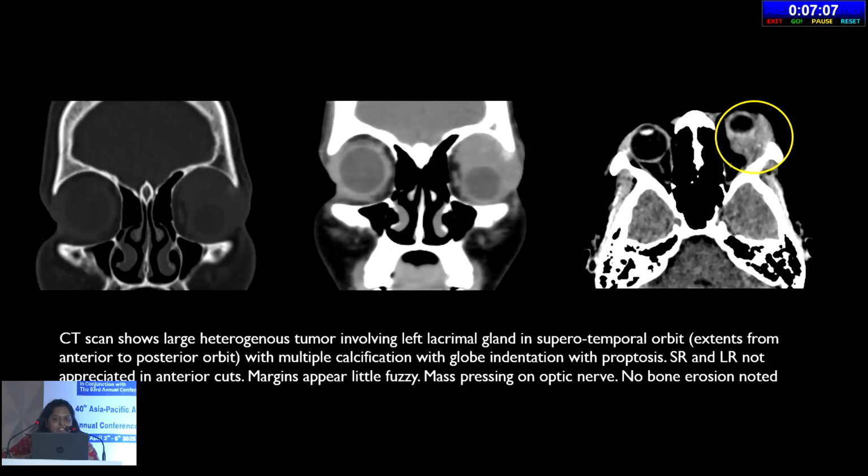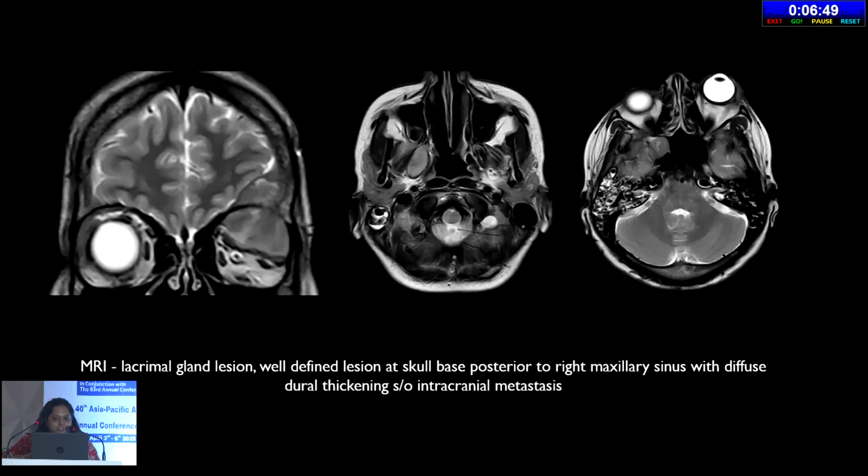CT scan showed a heterogeneous tumor involving the left lacrimal gland in the superior temporal orbit with multiple calcifications and globe indentation. The superior rectus and the lateral rectus were not visualized. Margins were appearing fuzzy and the mass was pressing onto the optic nerve. There was no bone erosion noted.